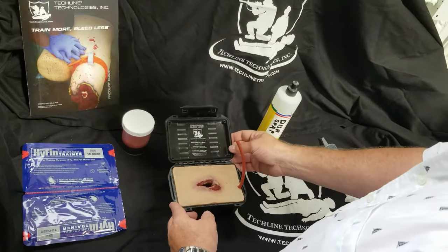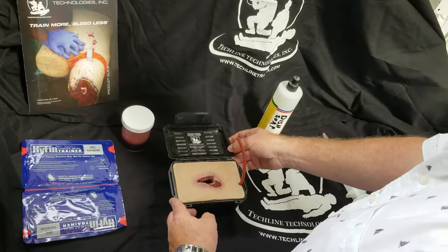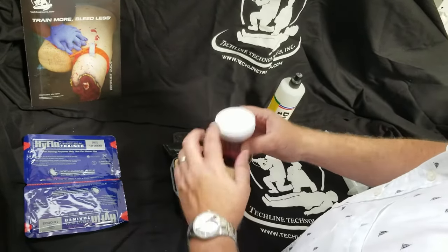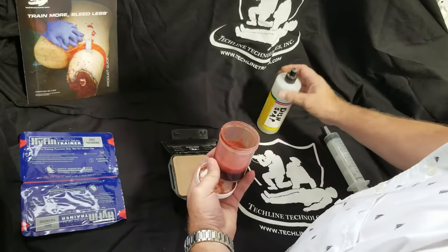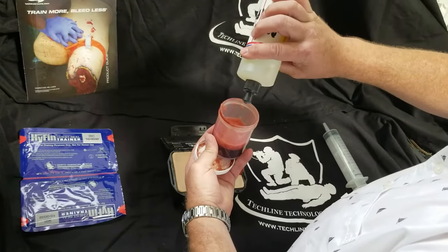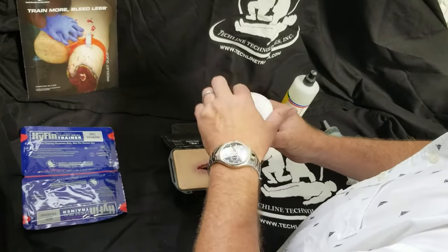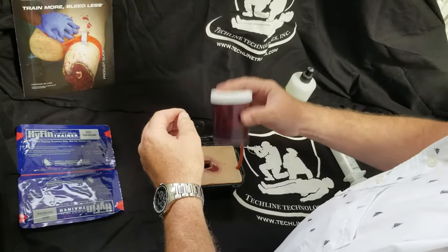This is how to use a Tecline wound-in-a-box as a sucking chest wound. First, mix up your blood simulant with a small amount of dish soap. This will give the frothing effect.